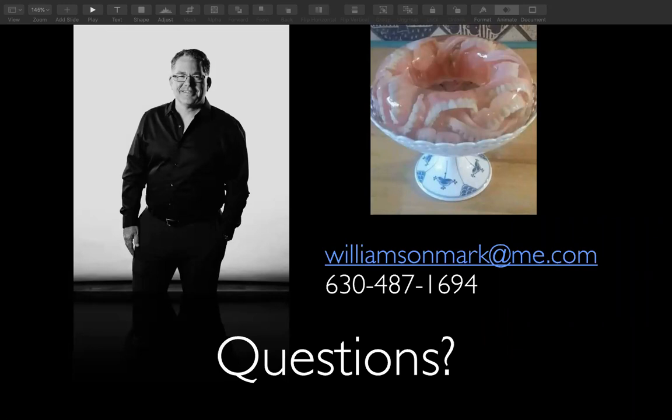All right. Next question: do you give any credence to the Shimbashi measurement? If so, where between 15 to 18 millimeters do you desire to land, or does the initial VDO measurement you conducted on the face trump the Shimbashi?